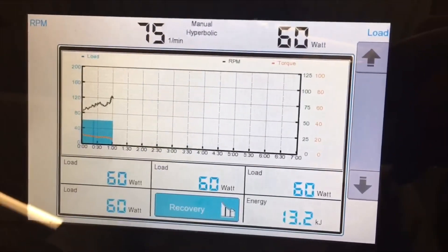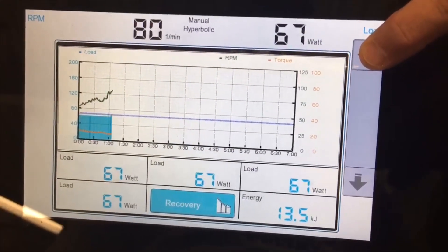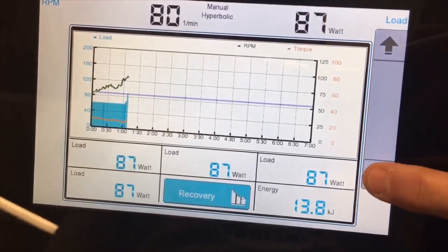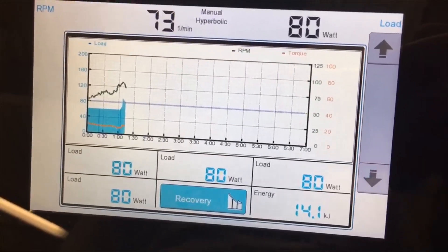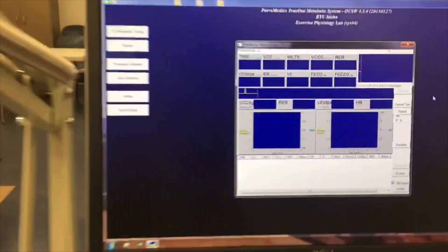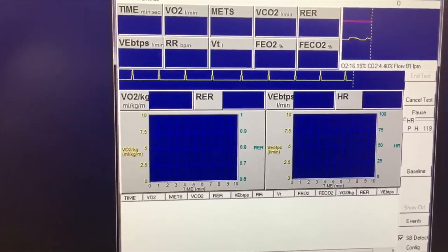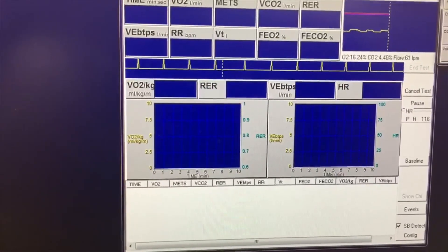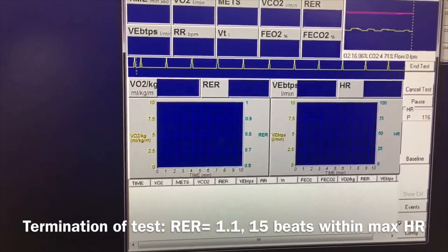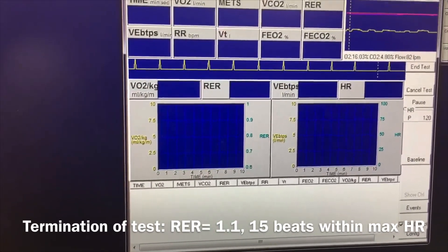We're going to increase the load to 80 watts and start our test. It's going to record data on our screen every 15 seconds, and we will do two-minute stages. Our goal is to get an RER — respiratory exchange ratio — of 1.1.